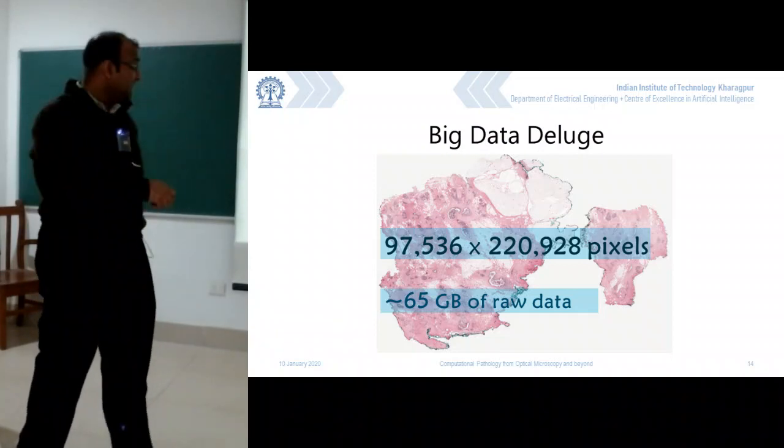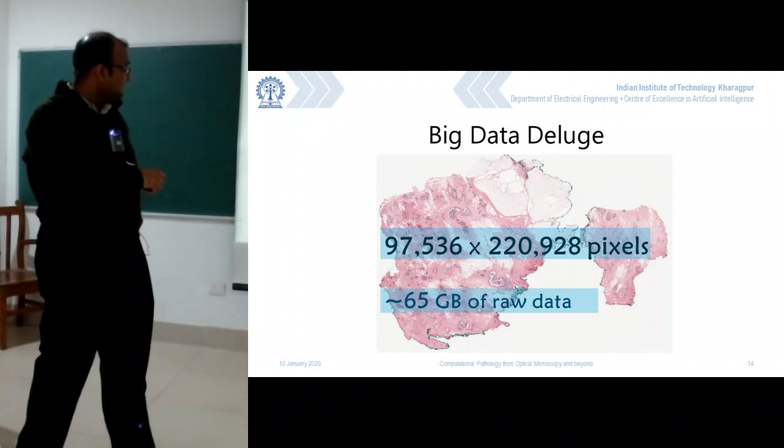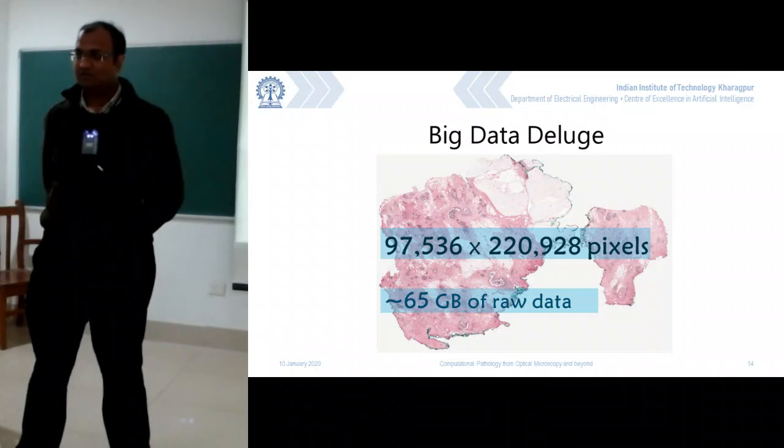So that's what we have done. We have put down some image processing that has analyzed that these are the regions where there is some useful information. So we store only them. Everything else is dropped off.